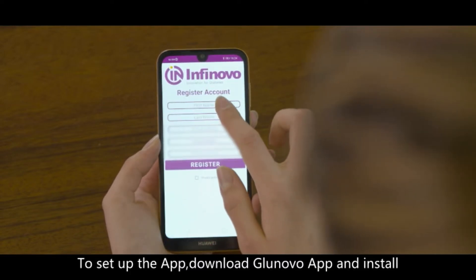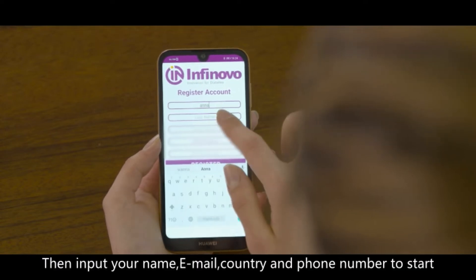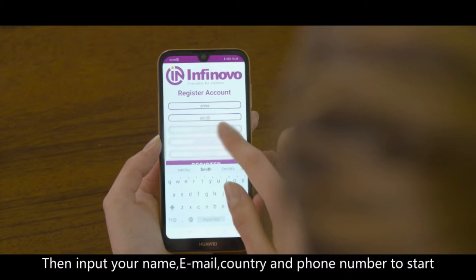To set up the app, download the Glunovo app and install. Then input your name, email, country, and phone number to start.